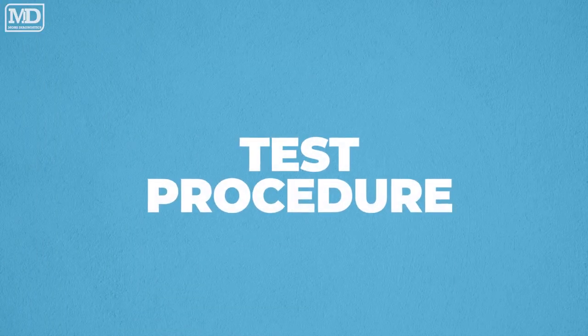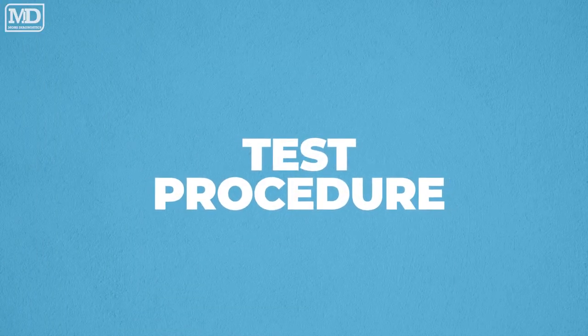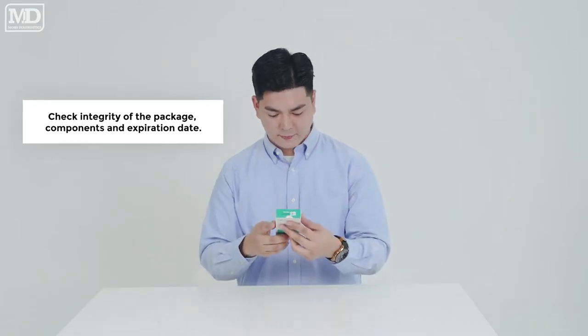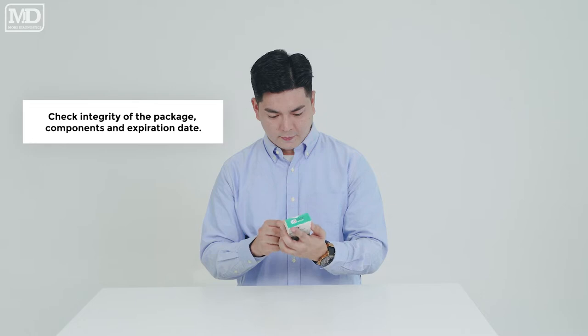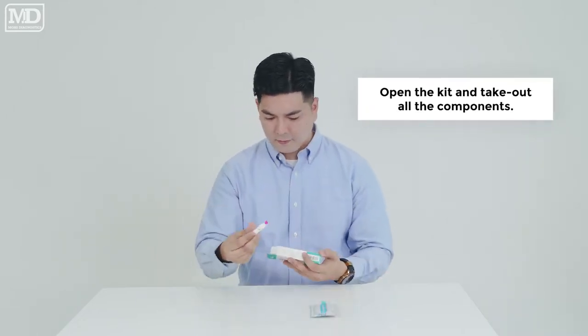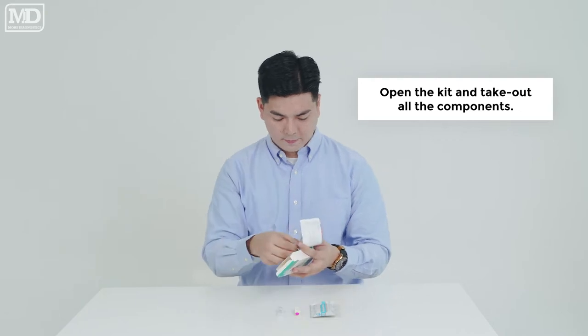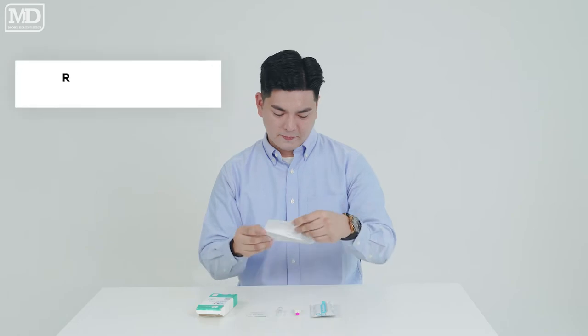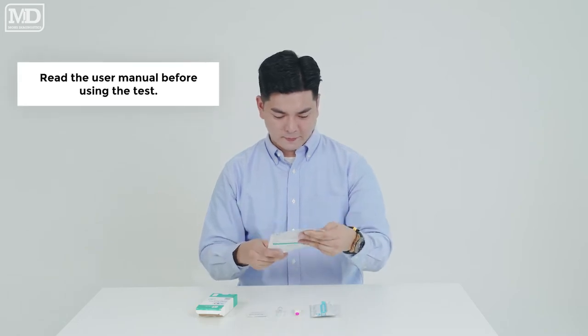Test Procedure. Check the integrity of the package, components, and expiration date. Open the kit and take out all the components. Read the user manual before using the test.